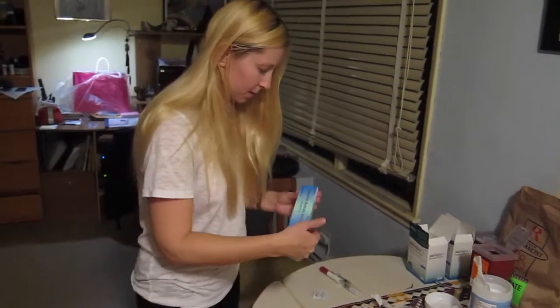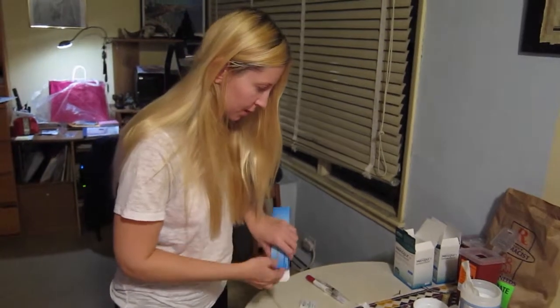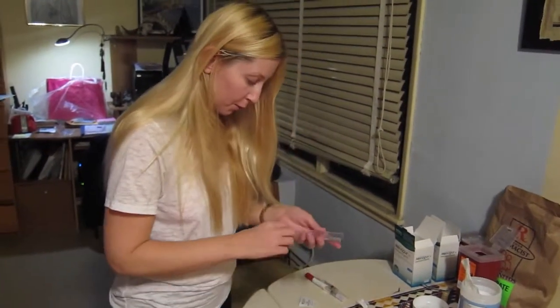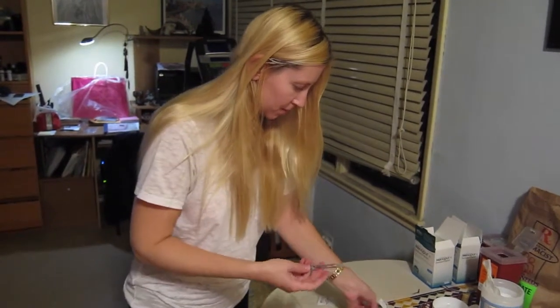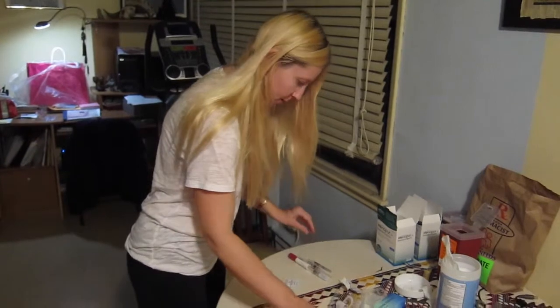The third one is Cetrotide. It's my addition for the last two days and I think it's to keep my ovaries from ovulating too soon. It's already pre-packaged. And here we go.